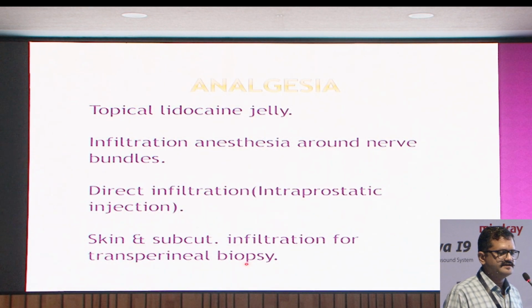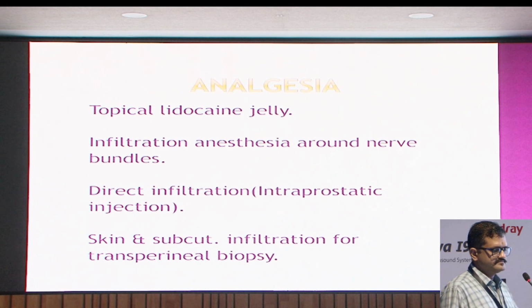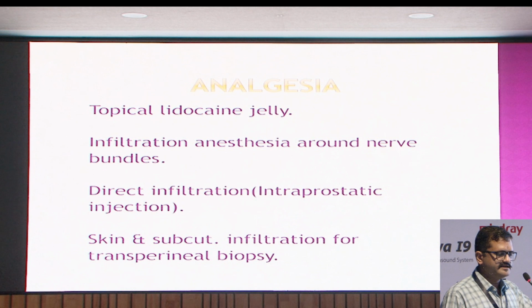For the biopsy, analgesia is a very important thing which should be dealt with. Most commonly, topical lidocaine jelly is used per rectally. While applying abundant lignocaine jelly, you cover up with your digital examination also. We as radiologists are not as good as you urologists in examination, but by that time you come to know whether it is nodular, hard or firm.